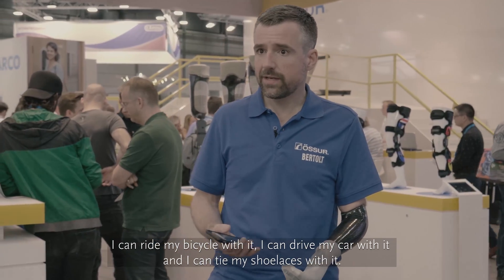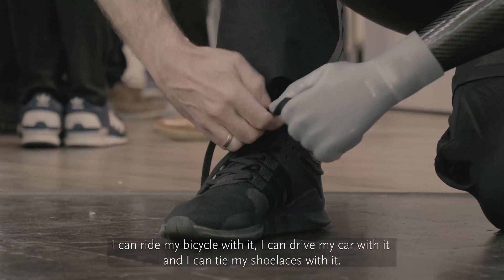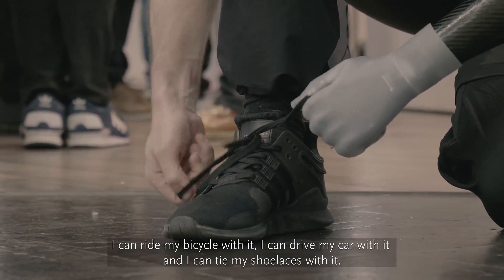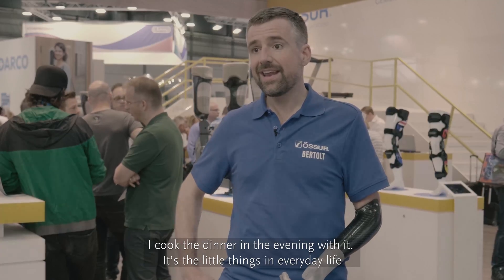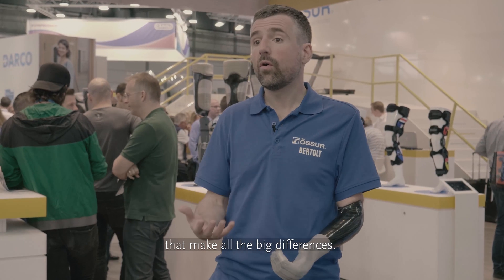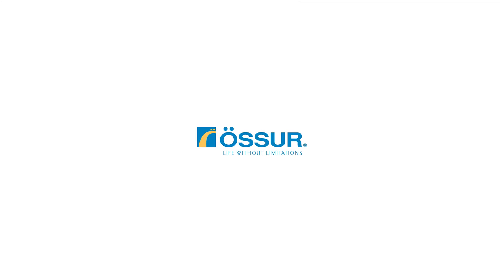I can ride my bicycle with it. I can drive my car with it. I can tie my shoelaces with it. I cook dinner in the evening with it. It's the little things in everyday life that make all the big differences. Thank you.